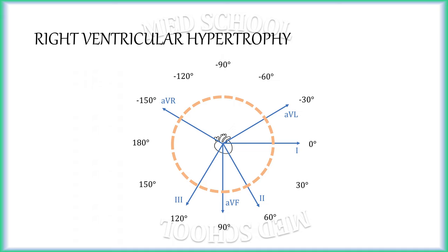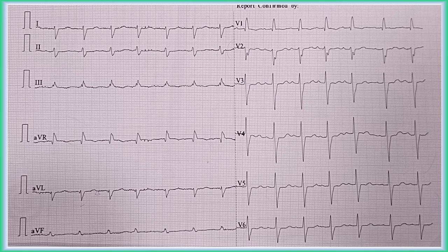When the QRS axis is present in the northwest region — i.e., between 180 degrees to minus 90 degrees — the most consistent ECG pattern will be prominent positive deflection in lead aVR and prominent negative deflection in lead II. In this ECG, there is prominent positive deflection in lead aVR along with prominent negative deflection in lead II, which indicates presence of QRS axis in the northwest region.